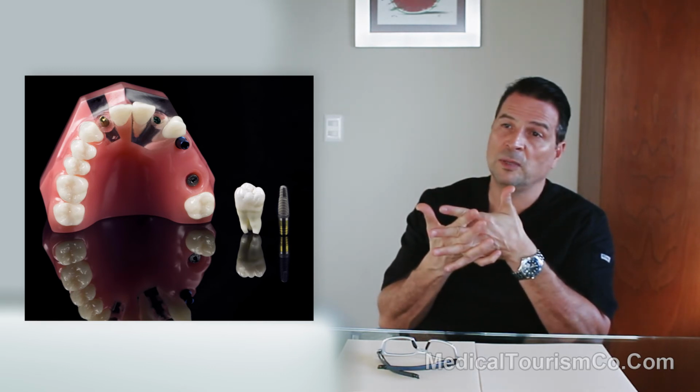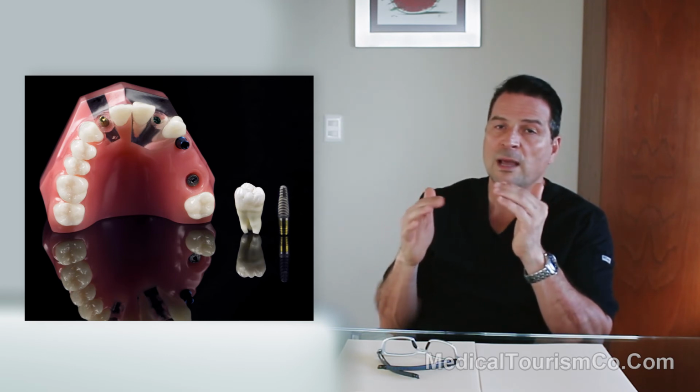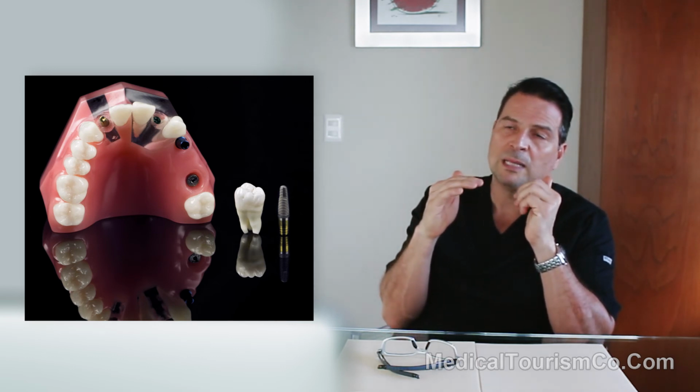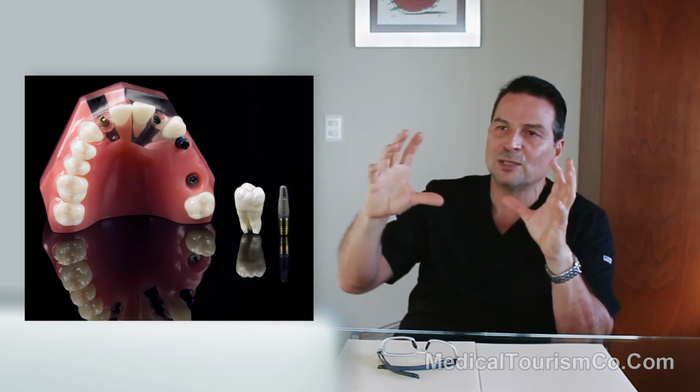That in the anterior segment is something that's indispensable. You have to have the aesthetics. Some patients have a low smile line and they won't show it, but still, you want to have something that's matching all the natural teeth, and that is the way to do it. And again, with this type of loading in single implants, we will do that temporary, that will be made out of acrylic again. And a few months later, 4 to 6 months later, we will change that for a porcelain crown.